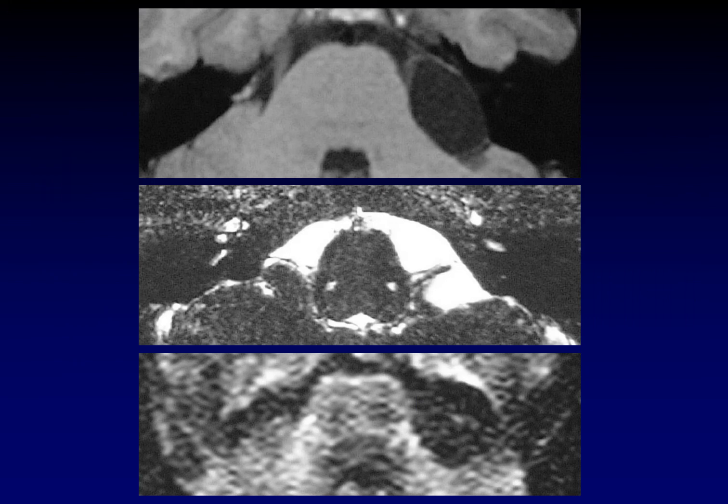Here's another example of a mass, a cystic mass in the cerebellopontine angle cistern. Here it is, dark on T1, matching CSF, bright on T2, matching CSF. And this time when we pull up the diffusion weighted images, there is facilitated diffusion, dark signal. That lets us know that this is an arachnoid cyst in the cerebellopontine angle cistern. Maybe the smooth ovoid configuration, nice well-defined margins, maybe that was another clue for us as well.